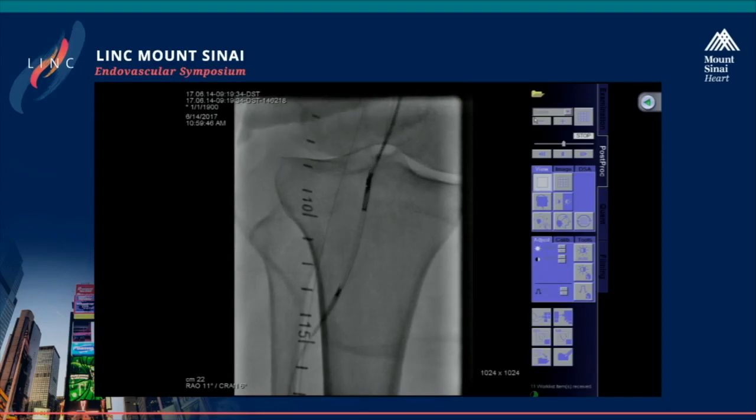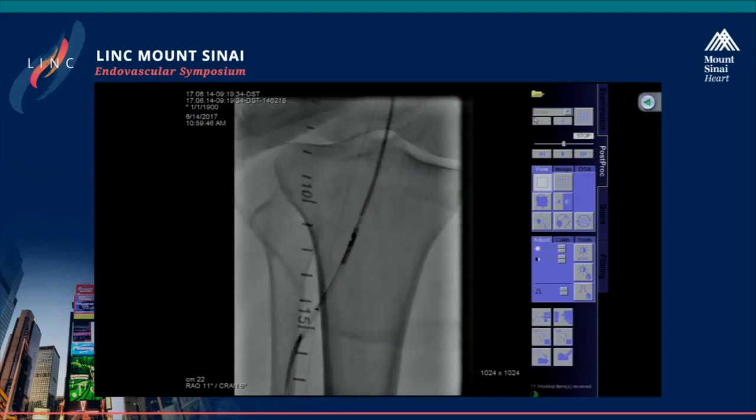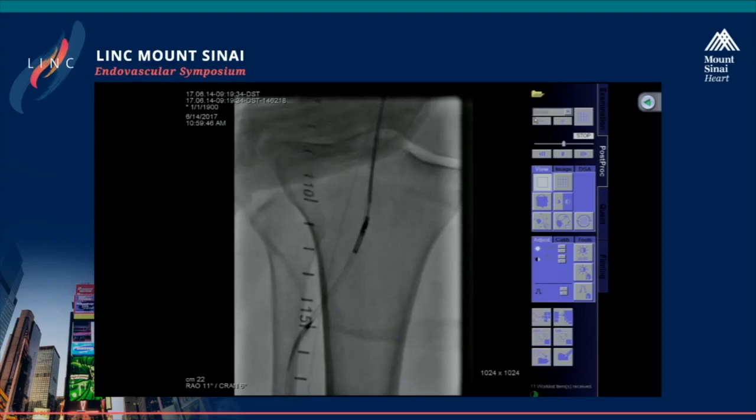In my opinion, I wouldn't use an atherectomy device because we are not sure that they are really far away from the wall, so I would try to avoid a perforation. I would use a laser or go ahead just with a balloon. What is your opinion? I think that's right.